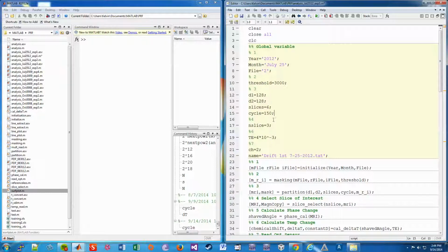Every cycle means there is a step in time, and that step is something that you set up with the MRI. You can find that information for the time step in the MRI method file, which I'll go into in detail later on. That's usually something you ask the MRI operator, and they'll tell you the exact time per repetition or per cycle. And that's something I usually write down in my MRI handbook notes too.